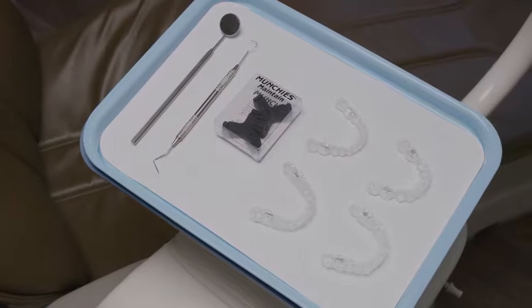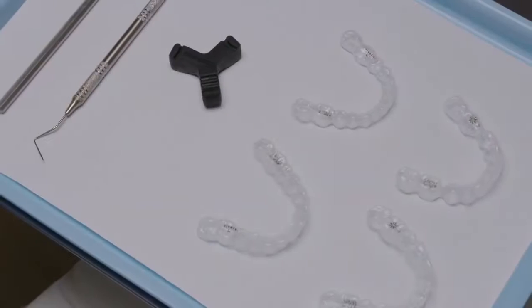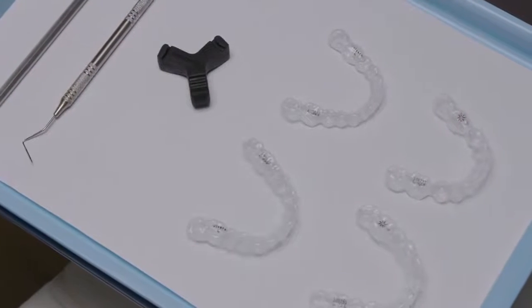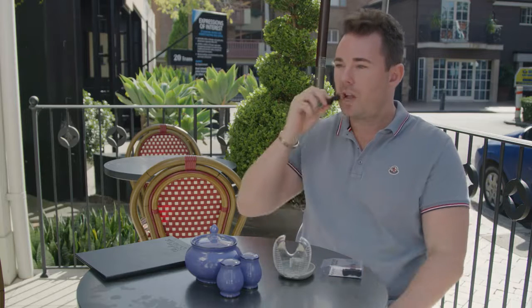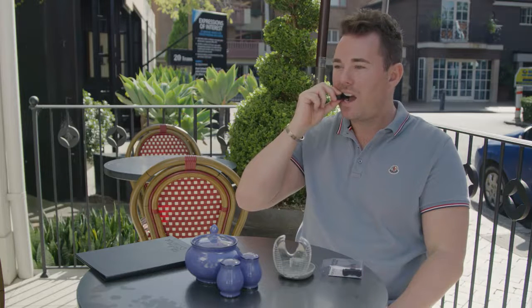As clear retainers are generally 30% thicker and more rigid than aligners, optimal seating of the retainers can be more challenging. Munchies Maintain devices have been designed to optimize the seating of clear retainers after your patients have completed any forms of orthodontic treatment.